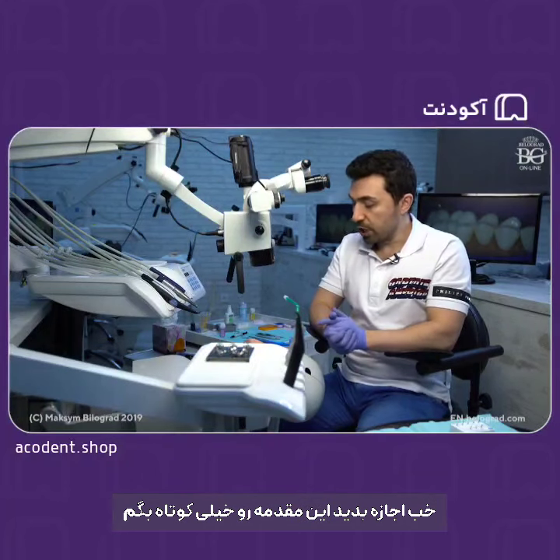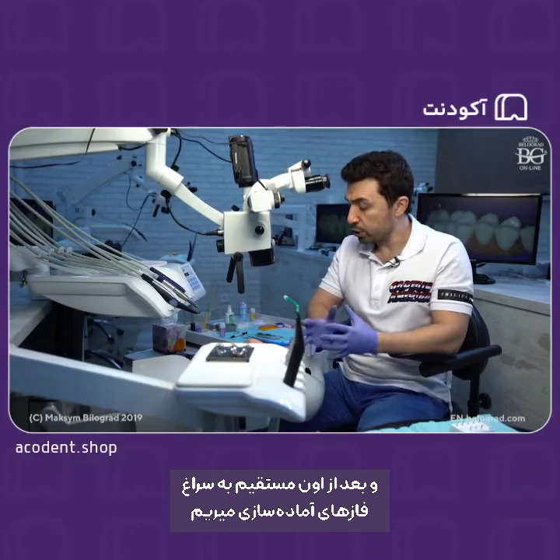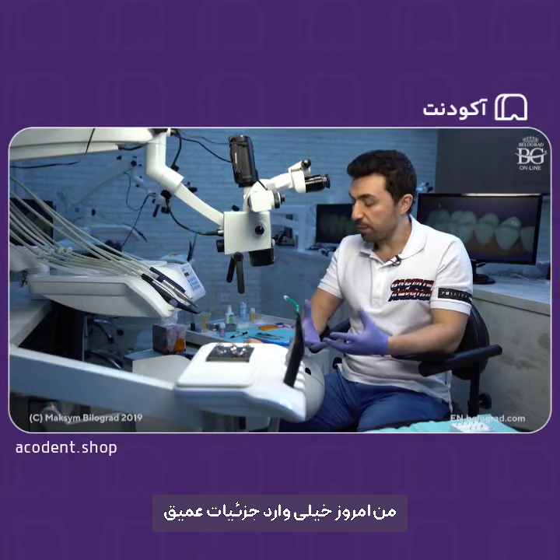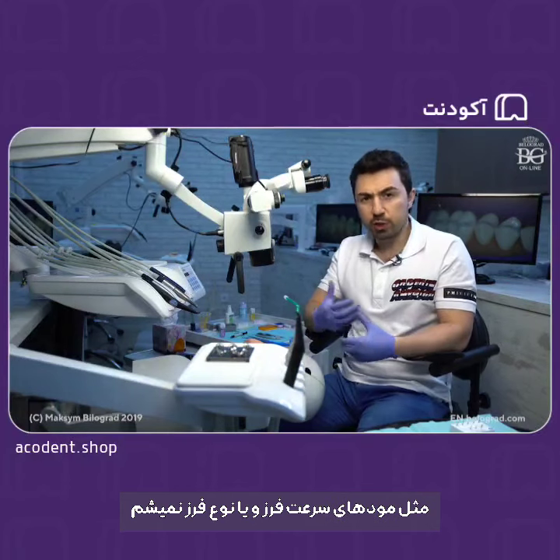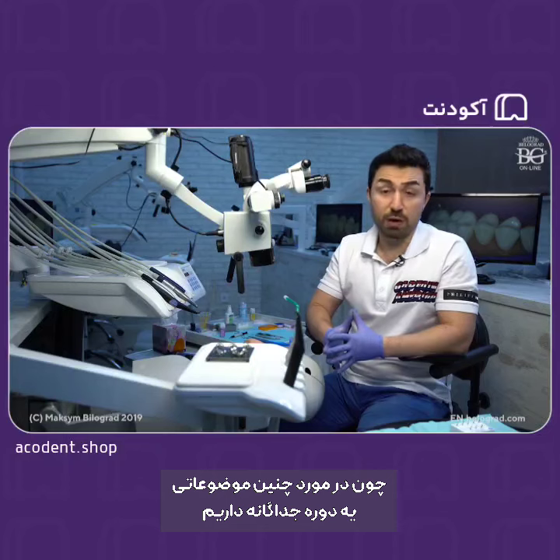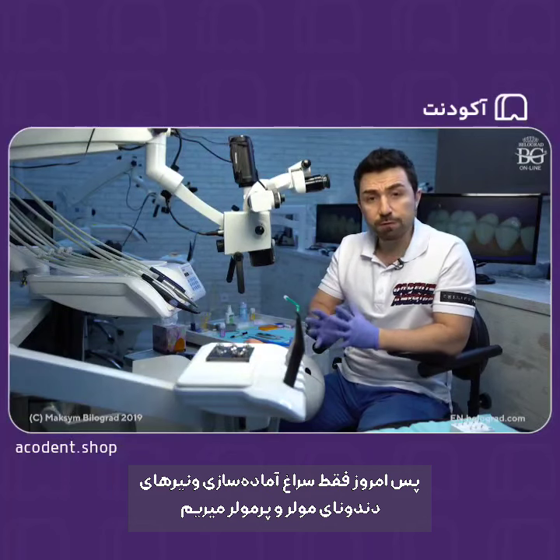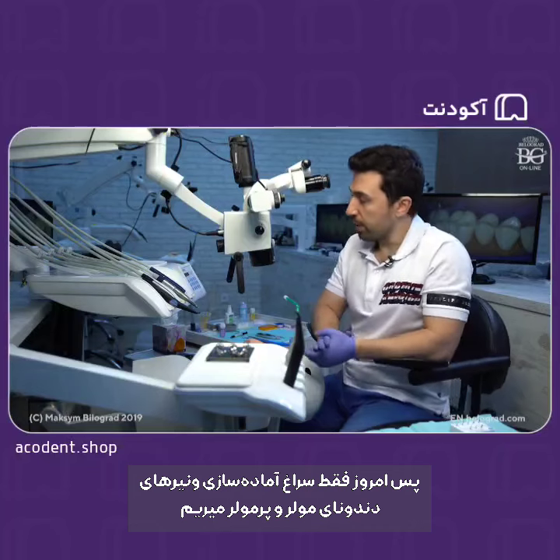Okay, so let me make this introduction really short and we will go straight to the preparation phases. I won't show you and explain really deep details regarding technical aspects of preparation, I mean speed modes, different burr sets, etc., because we have a separate online masterclass about this. We will go straight to preparation for veneers of these molar and premolar teeth.